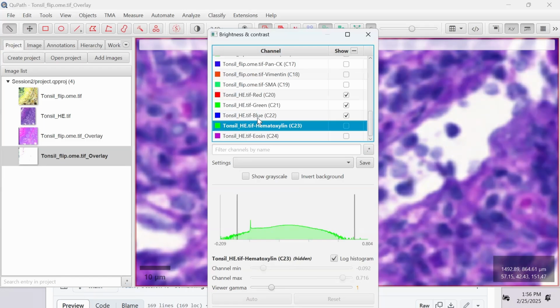So in case my multiplex staining protocol works by staining for one color, then I'm using a stripping buffer, adding the next color and so on, so I do a sequential staining, is this the method to overlay all my single colors with QuPath? Basically, yes.